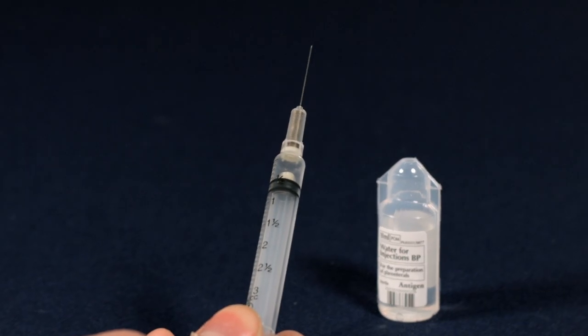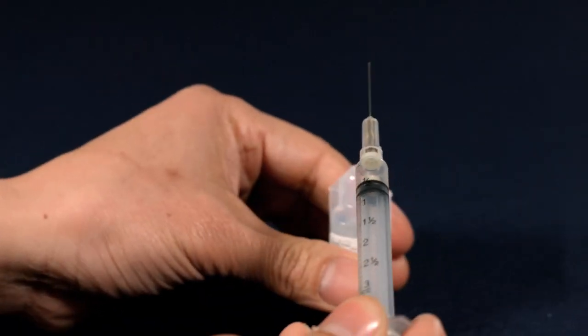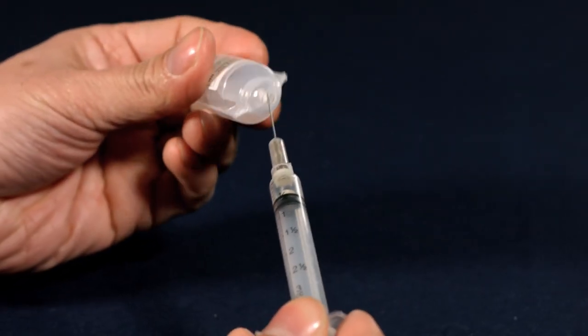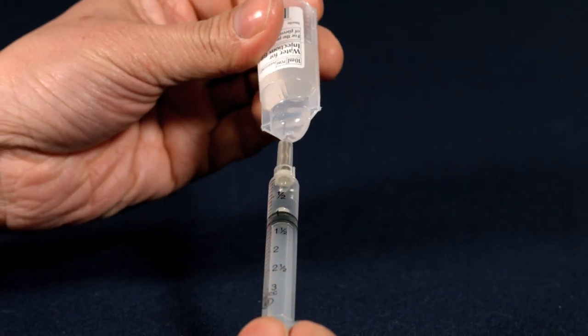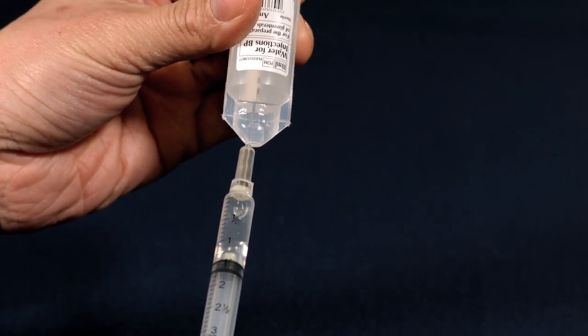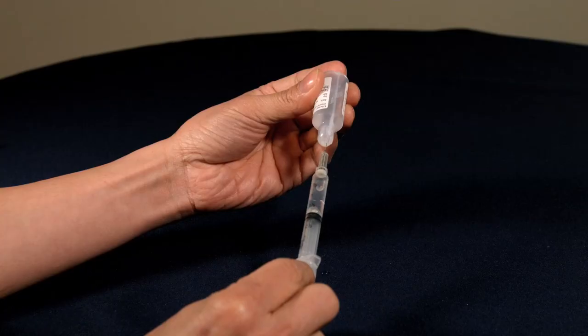Uncap the syringe, put the needle into the water vial, and slowly draw up between one and two milliliters of liquid by pulling back the plunger.